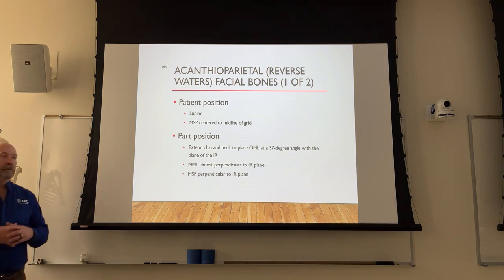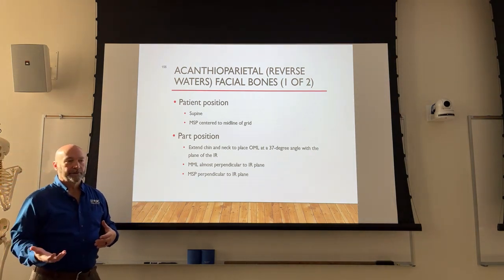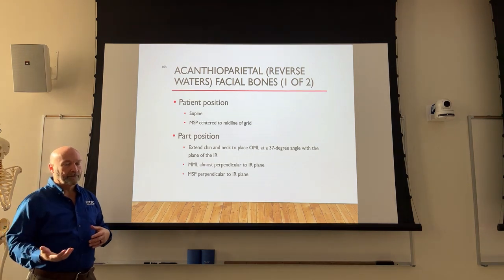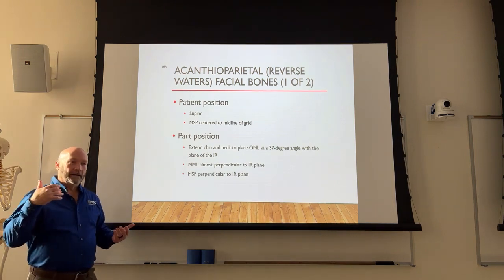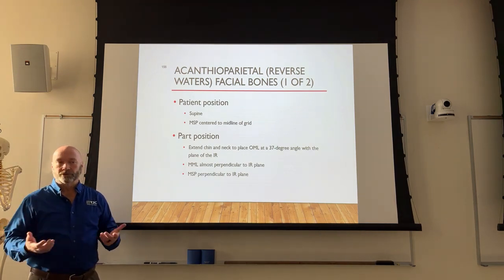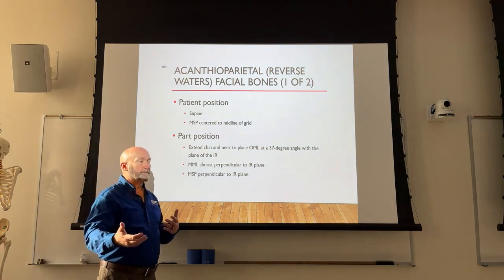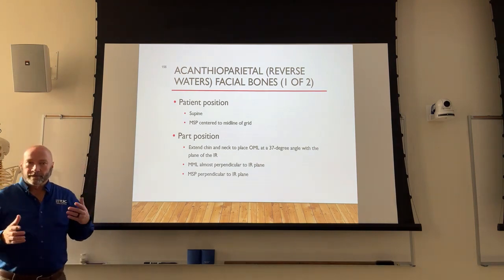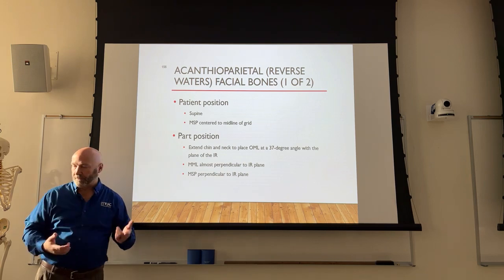So most of the time, if you're doing facial bones, a lot of times the patient's going to be on a backboard. They might have cleared them out of the collar, but they're still on a backboard, so you probably aren't going to be able to flip them over and shoot them PA. So you may have to shoot them AP. Or they may still be on the backboard and still in the collar. So you're going to have to make adjustments to your positioning in order to accomplish the same thing.